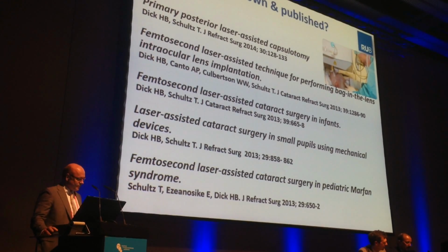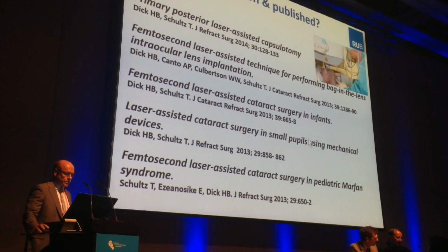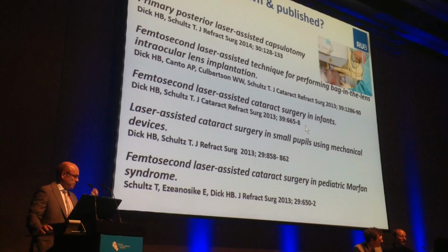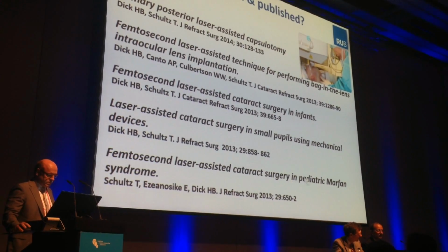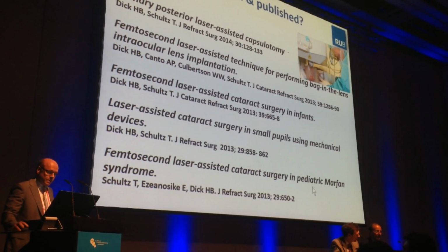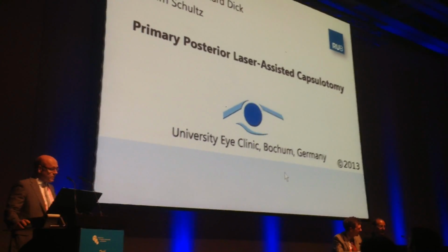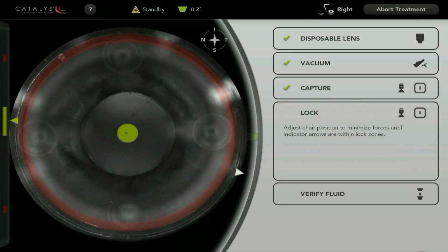We then also have published the technique of femtosecond laser-assisted cataract surgery in infants, as well as in small pupils, as Professor Ram already mentioned. And I also think this is a good option for Marfan syndrome, for example, because of the challenge we sometimes have in these eyes performing a capsulotomy. So first of all, I would like to show you the technique briefly on the primary posterior capsulotomy.